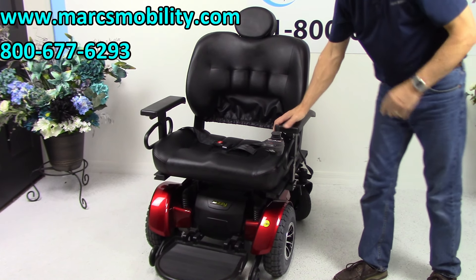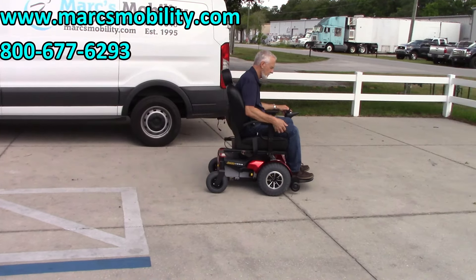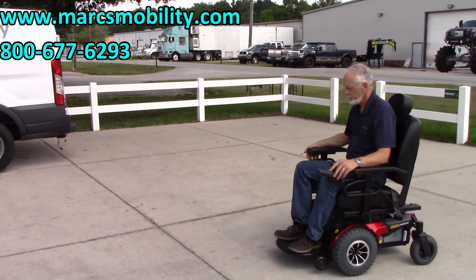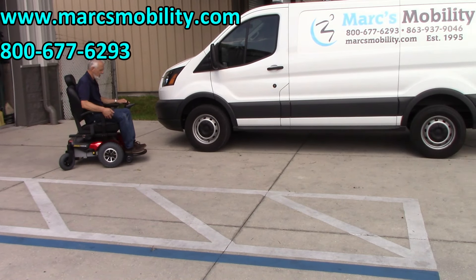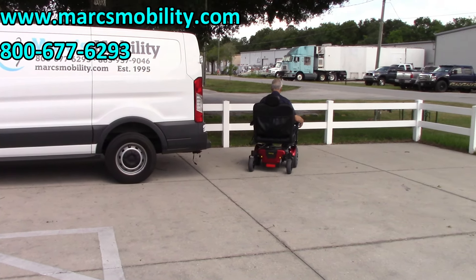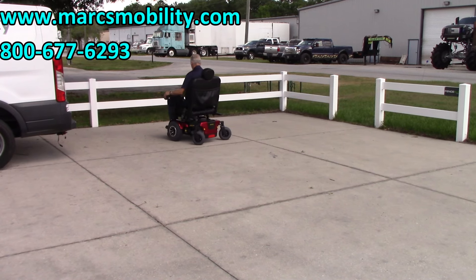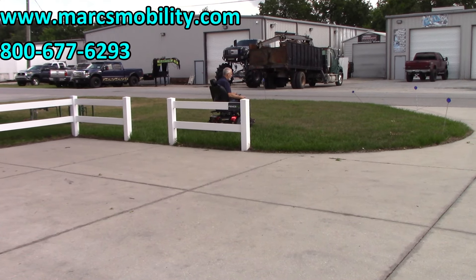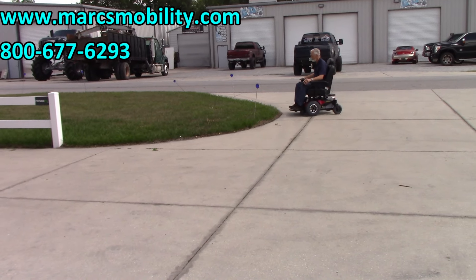This chair is practically brand new and ready to go. This is the big machine — built for a 600 to 650-pound person. As you can see, there's plenty of room in the seat. It turns very well and is easy to drive, very well built — one of the heaviest-duty power chairs Pride makes. No problem in the grass, even when it's a little bumpy and dry.